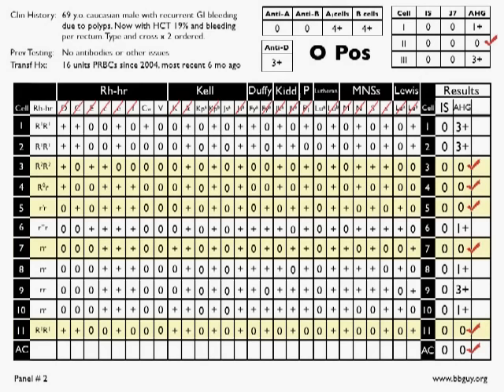Do it one way or the other. I would recommend, and you're probably best, being consistent with the rest of the people in your laboratory. But either way, that's how you do it. The way I do it in general leads to multiple cross-offs like this. Going beyond two, honestly, some people do that. I'm not sure it adds any value whatsoever.